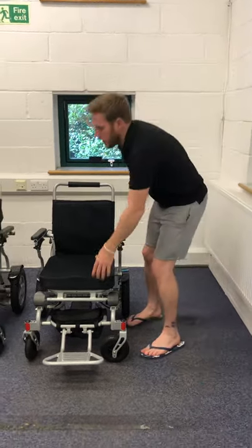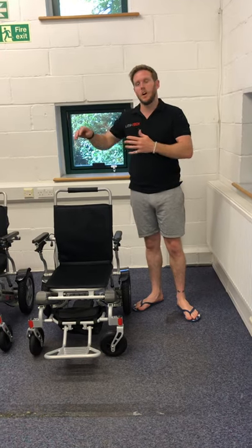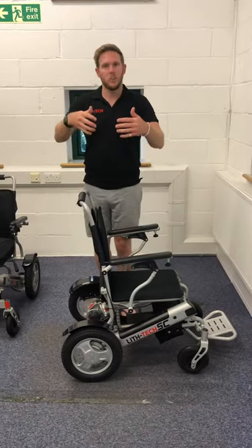I'm going to go through the folding and unfolding of the chair now. To make this chair really sleek — one of its great design features that makes it easier for lifting into the car, wheeling around, and makes it more compact — we're going to remove the cushion and put the chair on its side so you can see exactly what I'm doing.